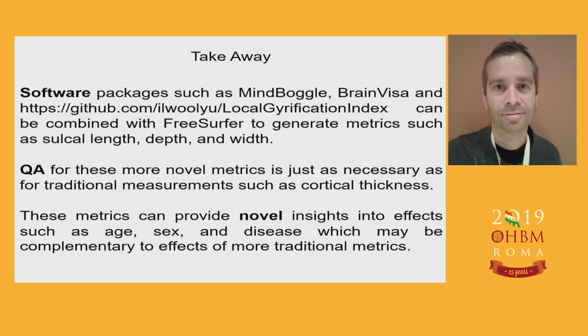Now, the takeaway messages from this talk are that software packages such as Mindboggle, BrainVisa, and others can be combined with FreeSurfer to generate metrics that are not standardly given by the FreeSurfer output. Quality control for these other novel metrics is just as important as you would do for a traditional morphological study. And we think that these less traditional measurements can be complementary to traditional metrics such as cortical thickness.